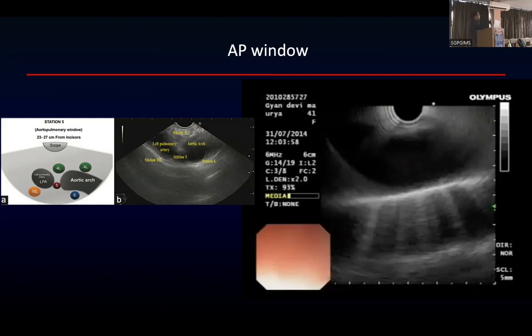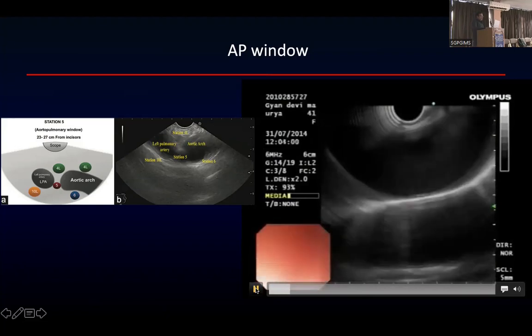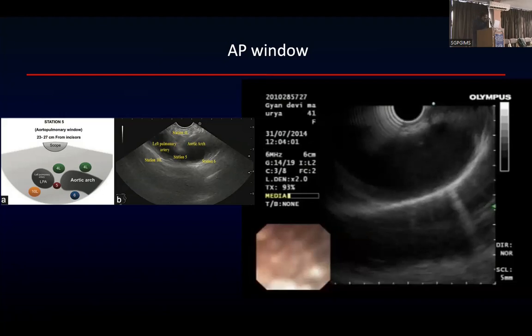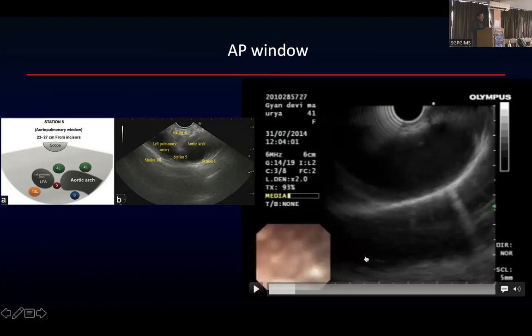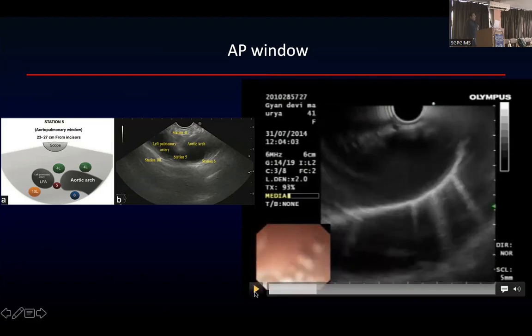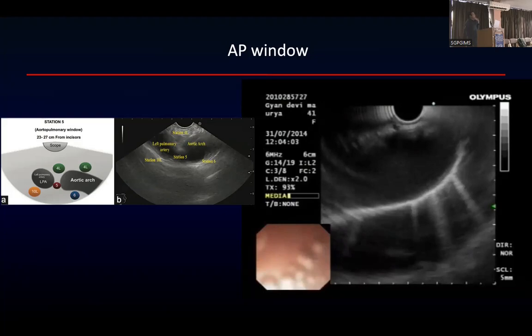What you do is, in the mediastinum, you rotate your scope to locate the aorta. That's the first step. What are you doing? See, you located the aorta first, right? You are locating the aorta. Behind the aorta this mirror image appears. This is known as a reverberation artifact, which is part of EUS imaging. So the aorta, the mirror image of the aorta, the reverberation artifact, and once you reach the top of the aorta, the aorta has started arching. Okay, that is the arch of the aorta. If you go above this you will reach the neck and you will see the left subclavian artery arising from it. I would say we don't need that.